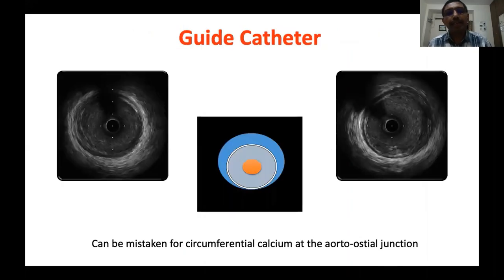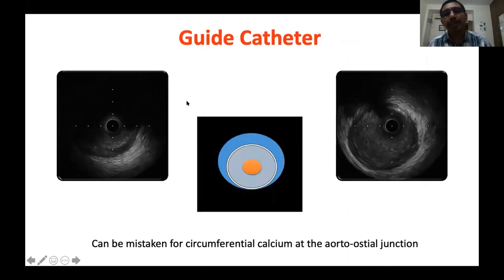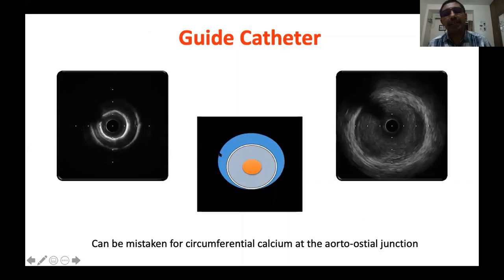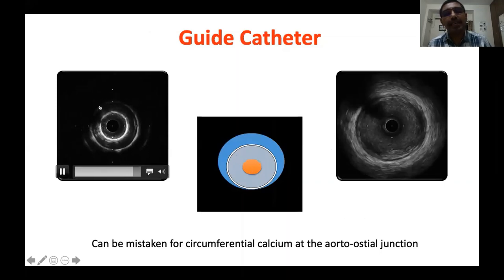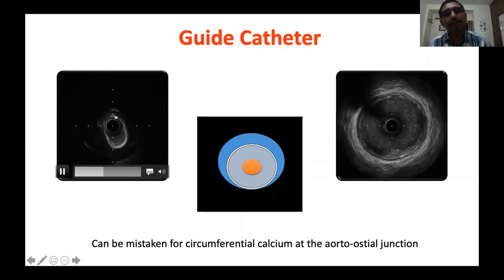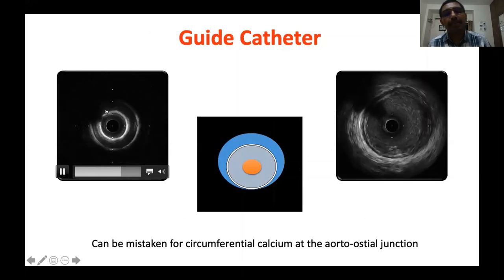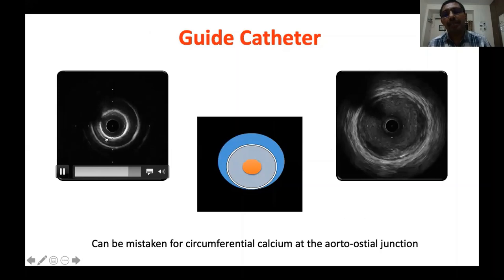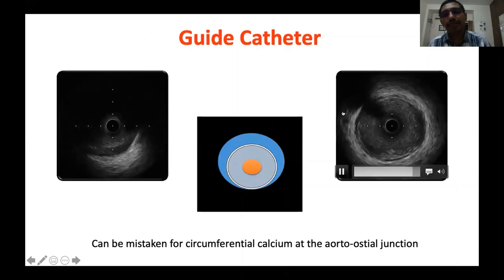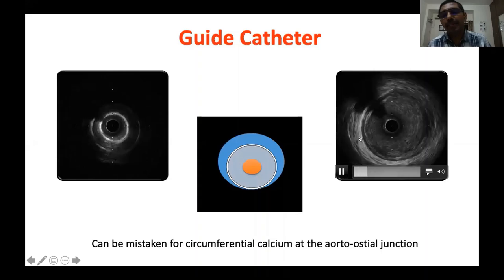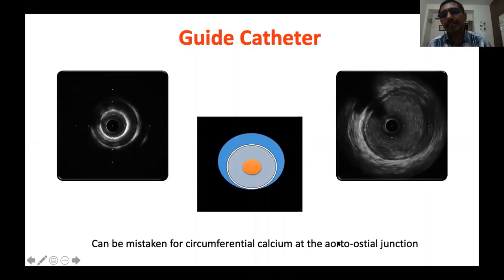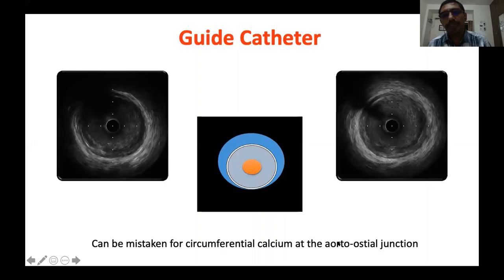The third artifact is the guide catheter artifact. Here you can see the guide catheter is deeply engaged into the artery. You should not mistake this for a calcified plaque at the ostium. This is the image when the guide catheter is inside — and this is the image when the guide catheter is removed. Do not mistake it for calcium at the ostium junction.